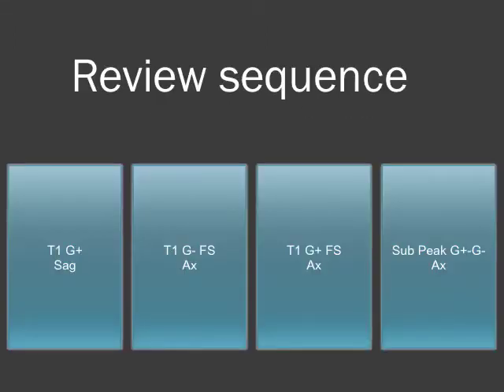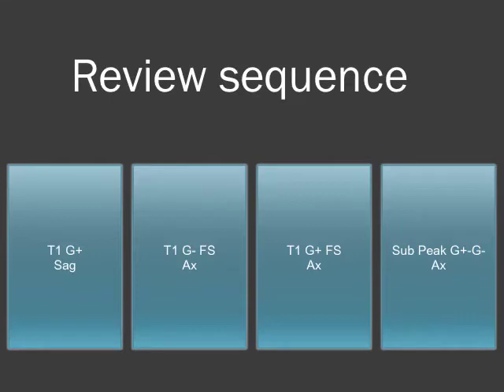This is the way I lay out the images on my monitors. I use a 2x2 display: on the far left, the T1 gadolinium-enhanced sagittal sequence, then the T1 no-gadolinium fat-saturated axials, followed by the T1 gadolinium-enhanced fat-saturated axials, and then on the right the peak subtraction sequence. The other sequences such as the non-fat-saturated T1 images or the T2 images I swap in as necessary. I think you need to have these images large to be able to see them, and I personally don't find the advantage of seeing eight different sequences at once.